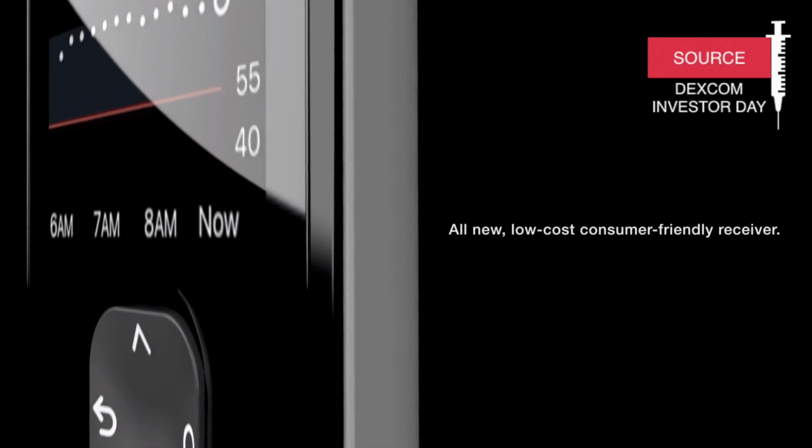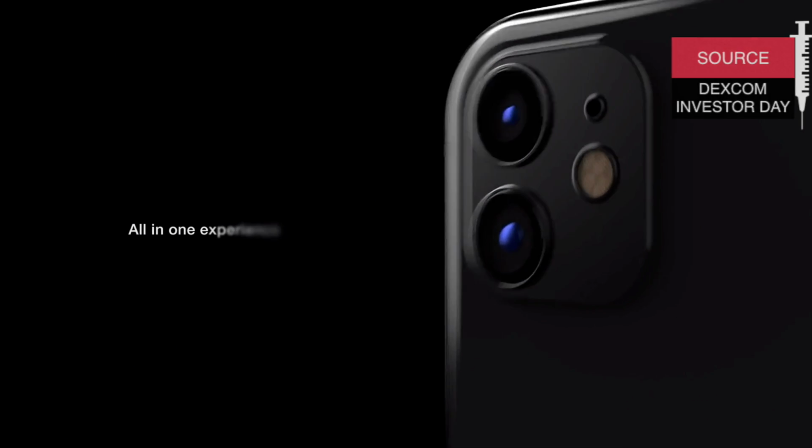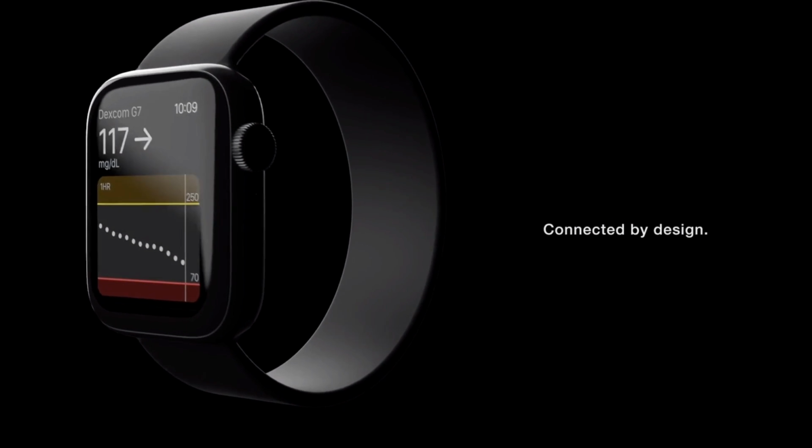You can't calibrate it within the native FreeStyle Libre app. Now I want to talk a bit more about apps and connectivity. Dexcom promised that the G7 will be paired with a brand new all-in-one app, which will include real-time glucose information combined with personalized insights. So it seems that this is one of their focus areas.